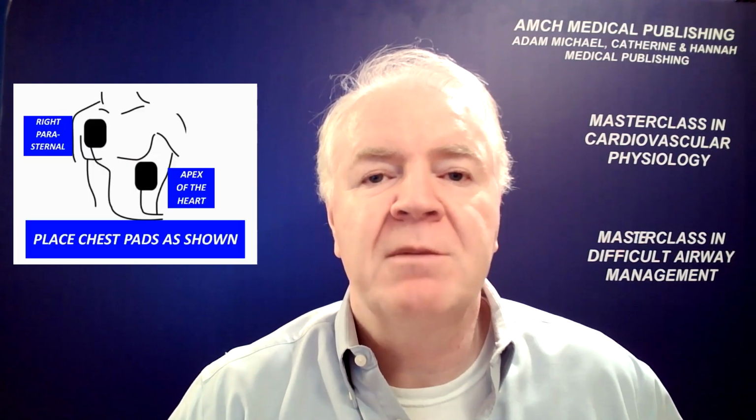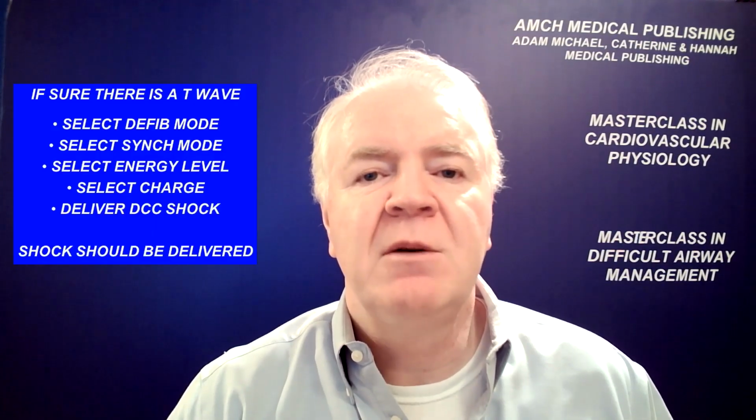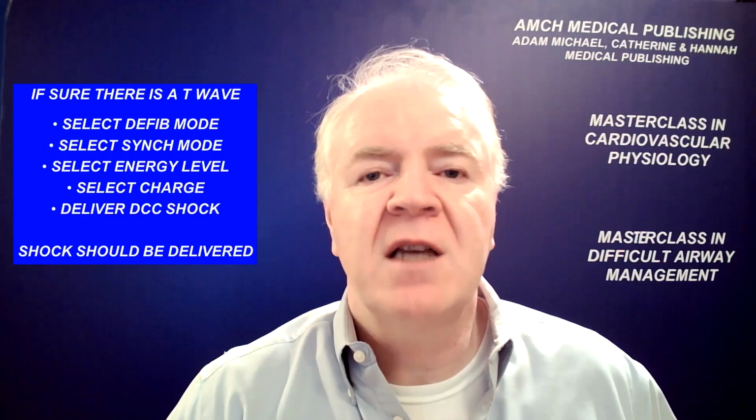First, we want to make sure that your Zoll defibrillator or equivalent machine can detect the cardiac rhythm, so apply a 3-electrode EKG configuration to left arm, right arm and left hip. Also apply a cardiac apex chest pad and a right parasternal chest pad. Choose monitoring mode and commence monitoring lead 2, which gives a maximum P wave height, and so it's the best choice for rhythm diagnosis. If you're just not sure if there is or is not a T wave, then your defibrillator can decide for you.